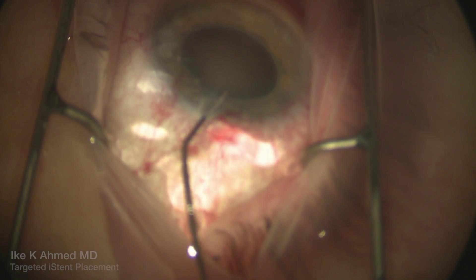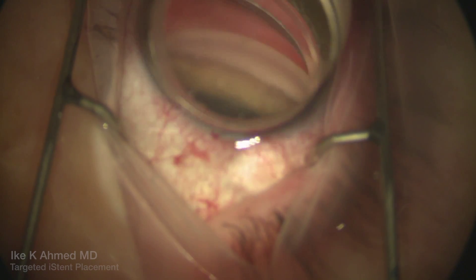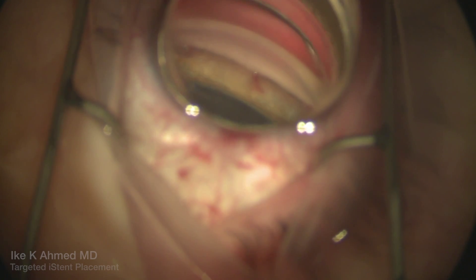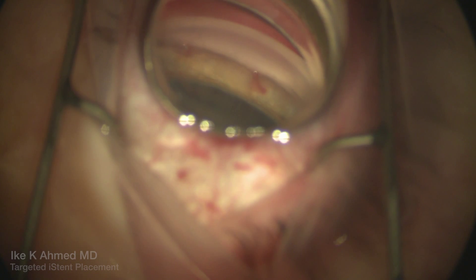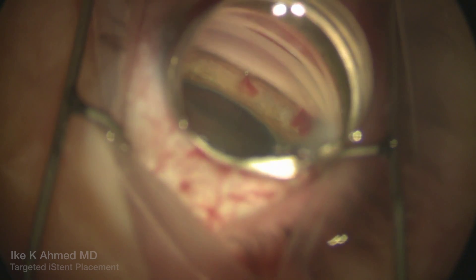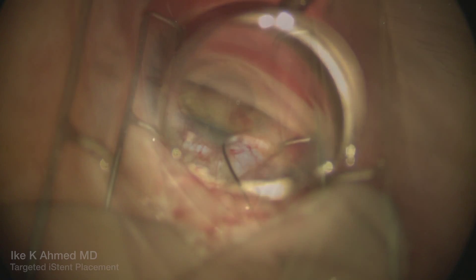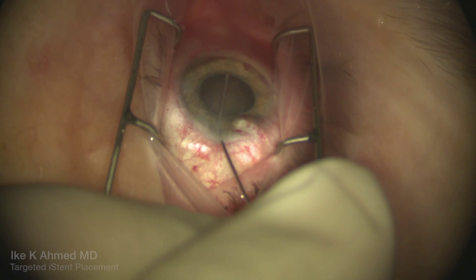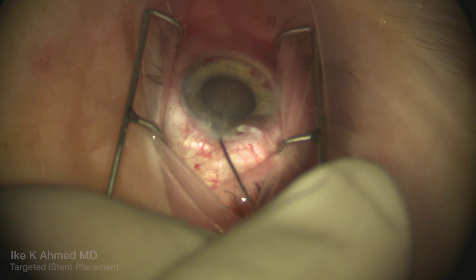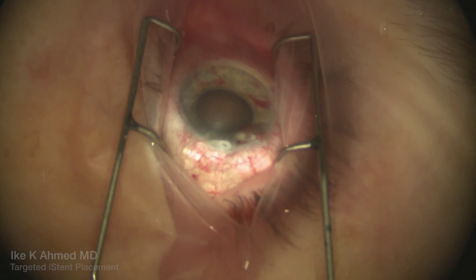We'll irrigate some of that blood out of the anterior chamber, lowering the pressure. We immediately see blood reflux emerging from all three of the stents placed, indicating we have a high chance we've put them in an area where there's a patent aqueous vein.